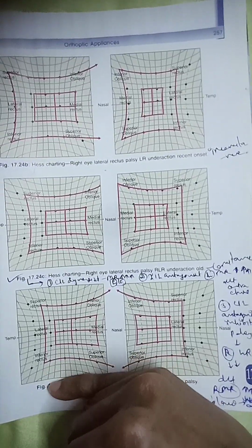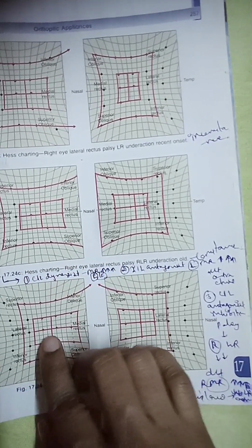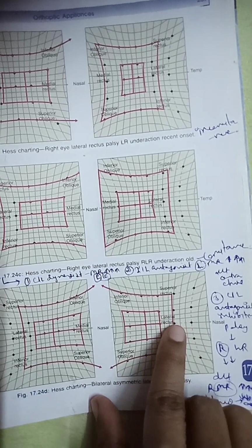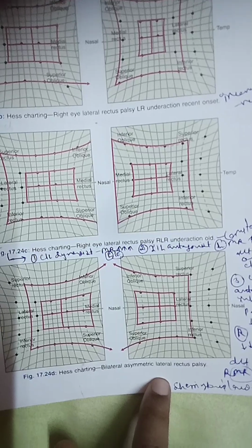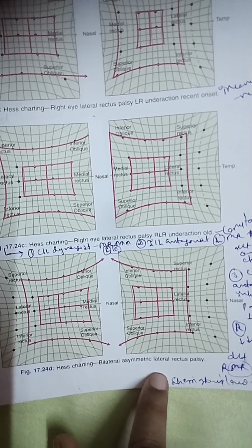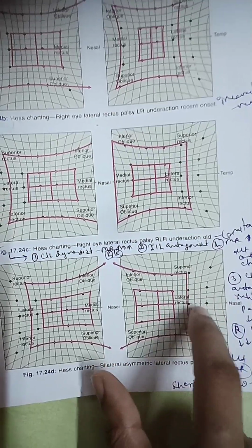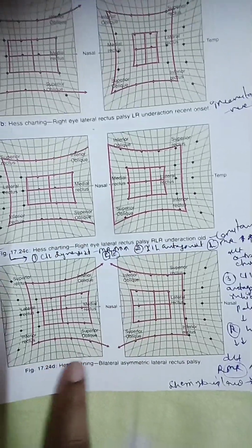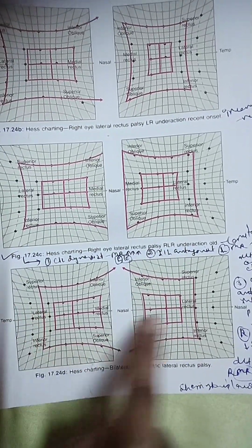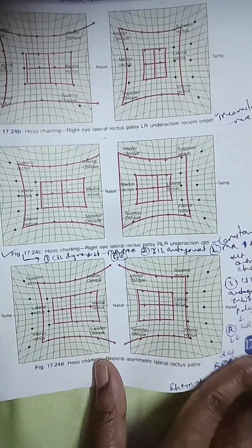So now we'll see here, we'll see almost equal are there. So you'll see 1, 2, 3 here, 1, 2. So this is affected, right lateral rectus, right? Yeah, right lateral rectus is affected first, and then it's like a spread of comitance. You can see almost similar. It is given bilateral. Yes, it is affected, but it can be in the process of the spread of comitance, and this must be first affected.